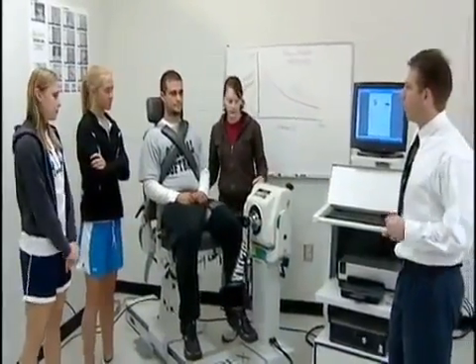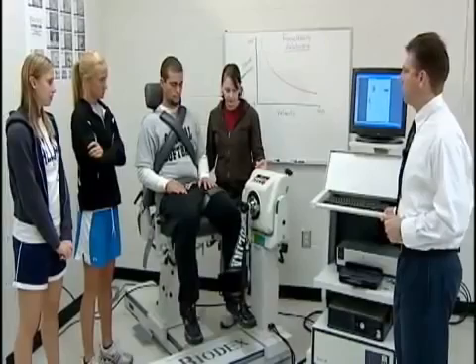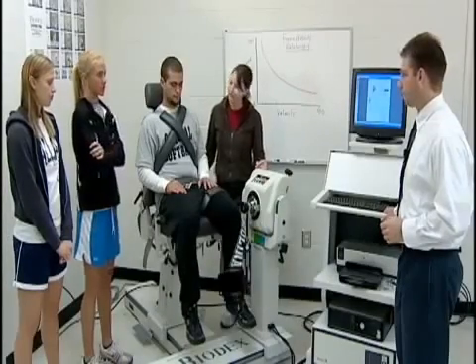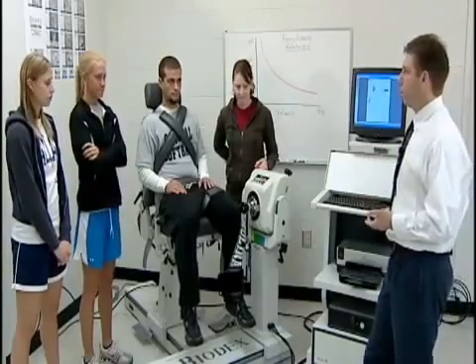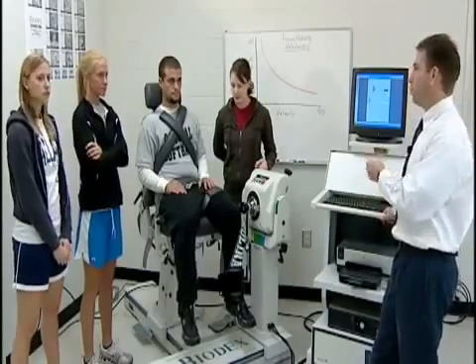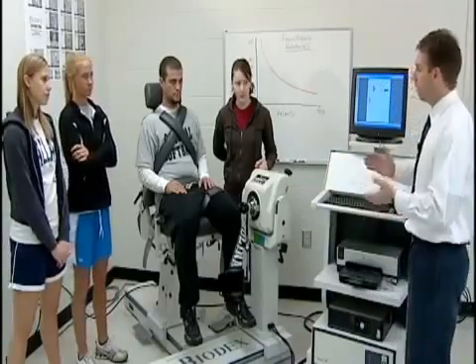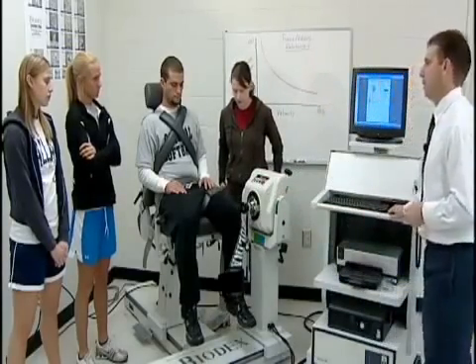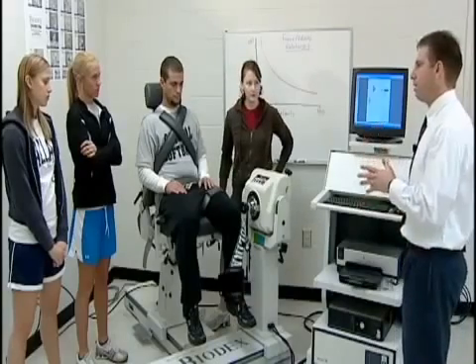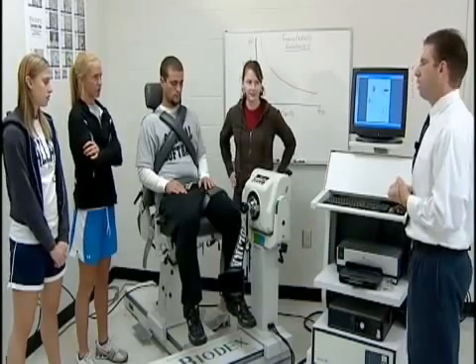We're setting him up to test his left leg. Why would we test the left leg versus the right leg in multiple muscle groups? To see the difference between the two legs — if one's weaker than the other, or if there's been an injury. If there's a muscle imbalance with an injured limb, we don't know how strong it was before the injury, so we compare the injured limb to the healthy limb to establish a starting point and a goal.